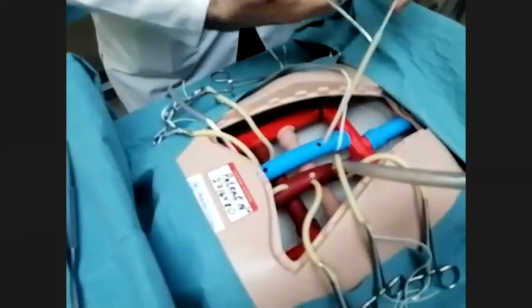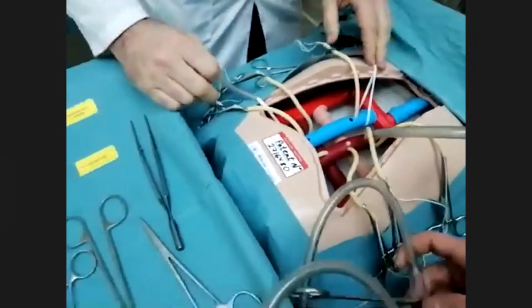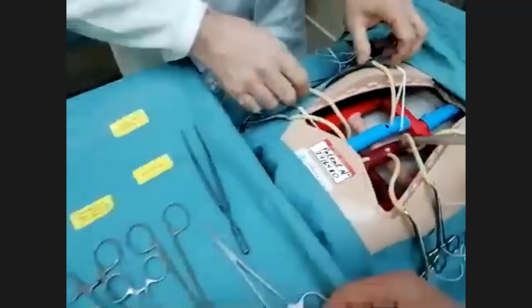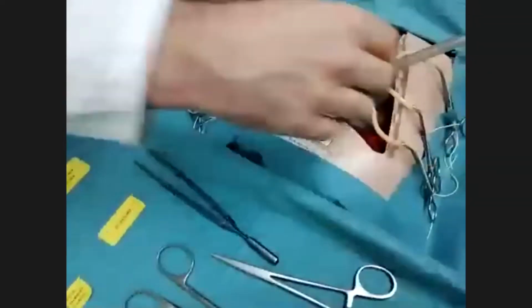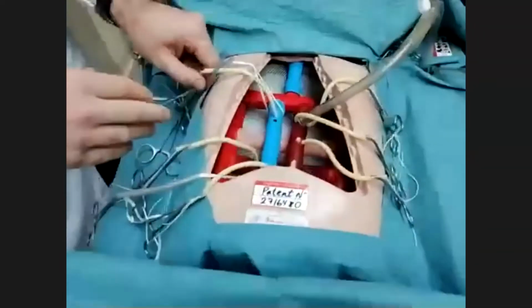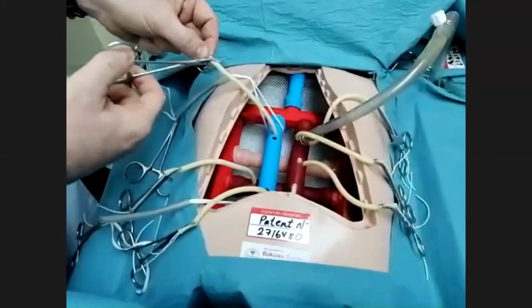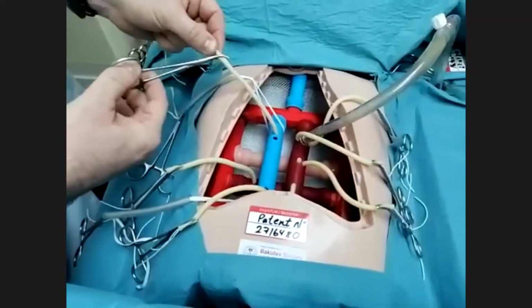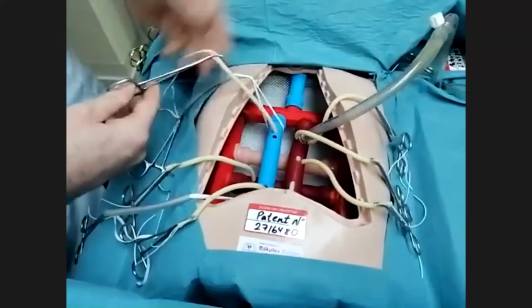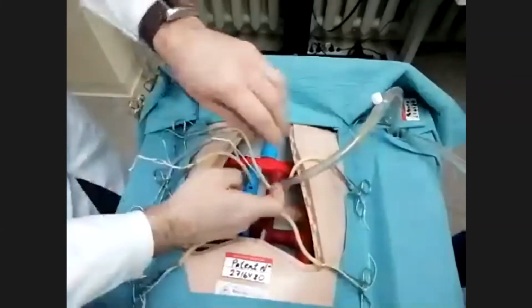Then we check the result of our procedure, the optimal result of our procedure, okay, and then we ask our anesthesiologist to give the protamine. It's the antidote for heparin, and after that we perform the decannulation of the aorta.